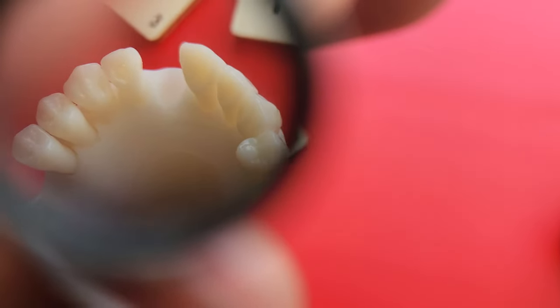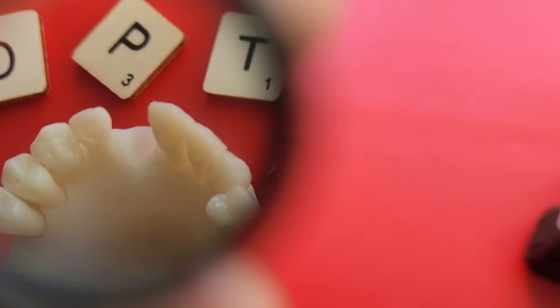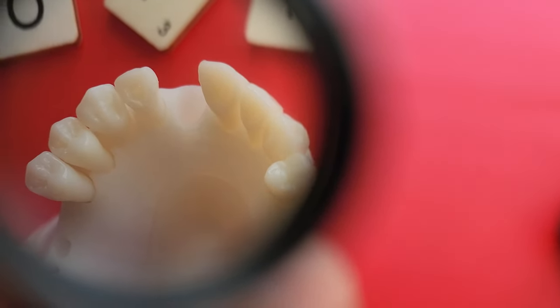Now for probably the most important part of a loupe: the quality of the prisms. These are top-notch — very clear image, no distortion, no blurriness around the edges, very clear from one side to another. The field of view was good and the depth of field is very good as well. You don't feel limited when examining patients. One thing really important to me is that what I see through my loupes matches what I capture on a macro lens photograph, and with these there was no significant difference.